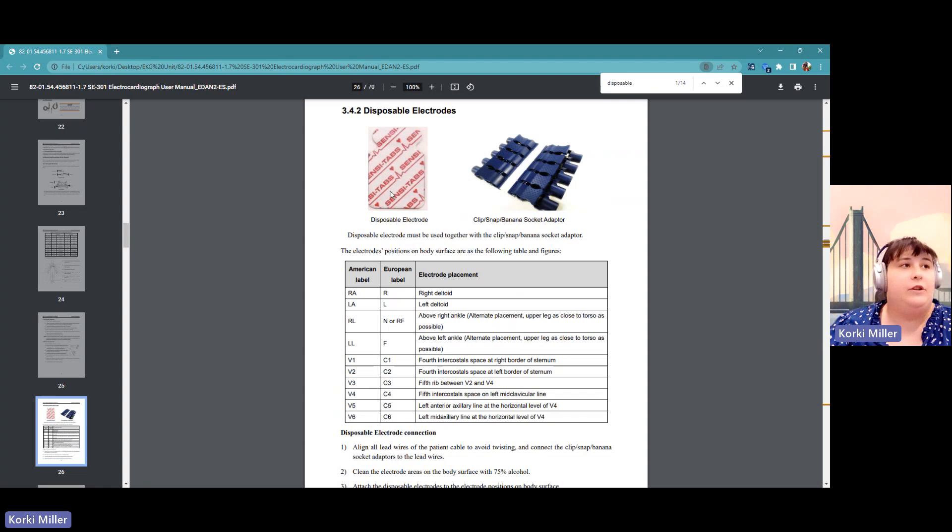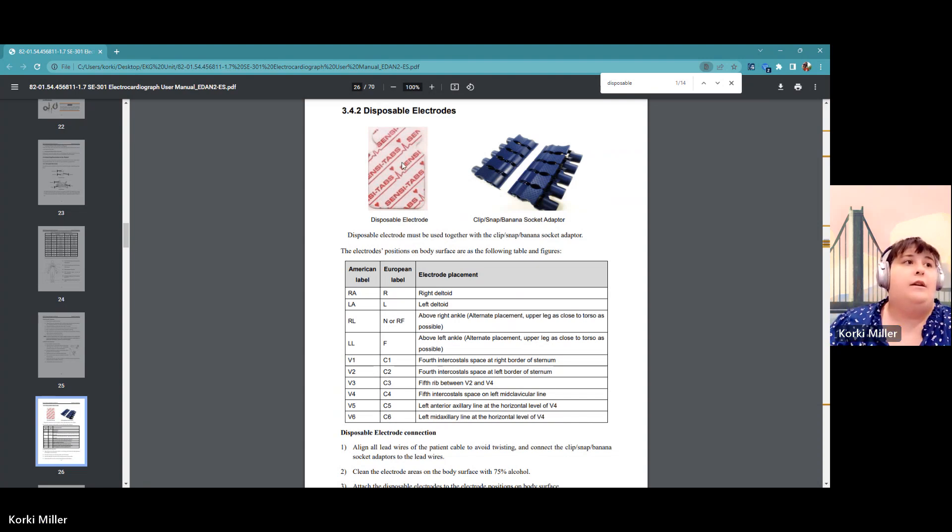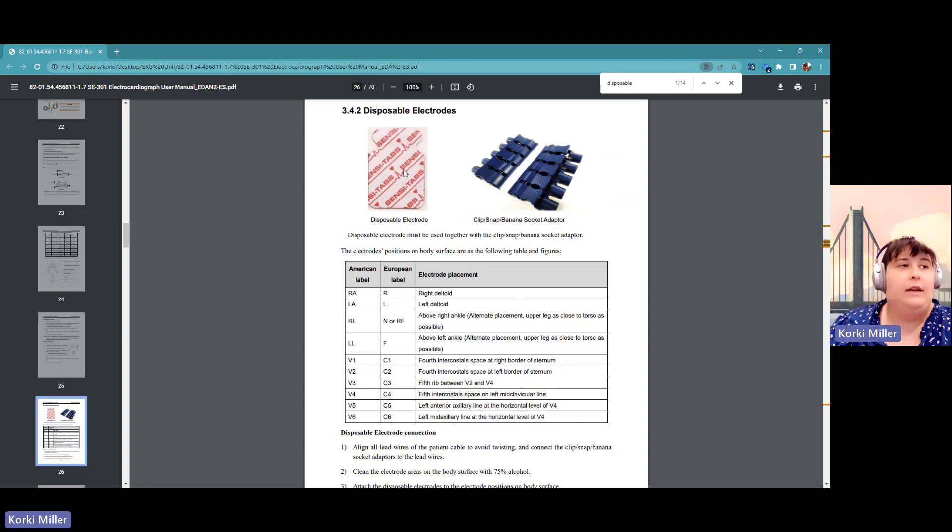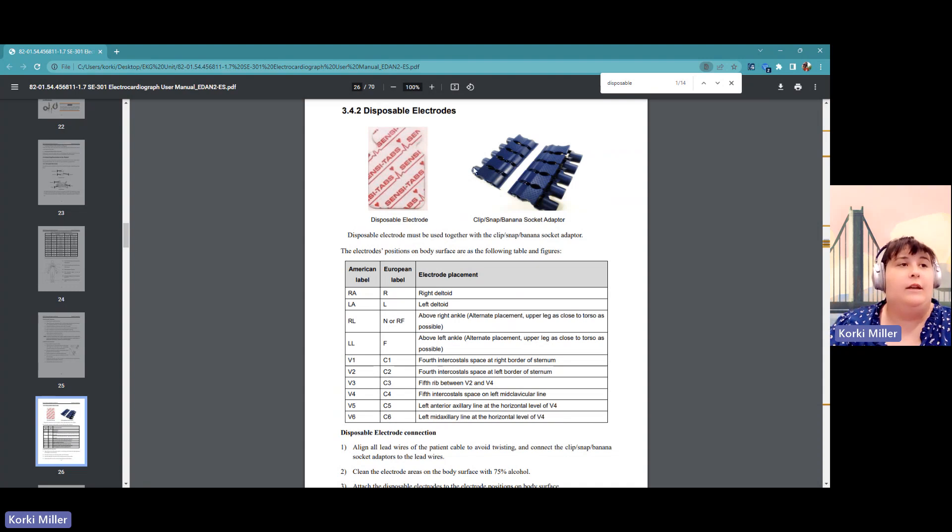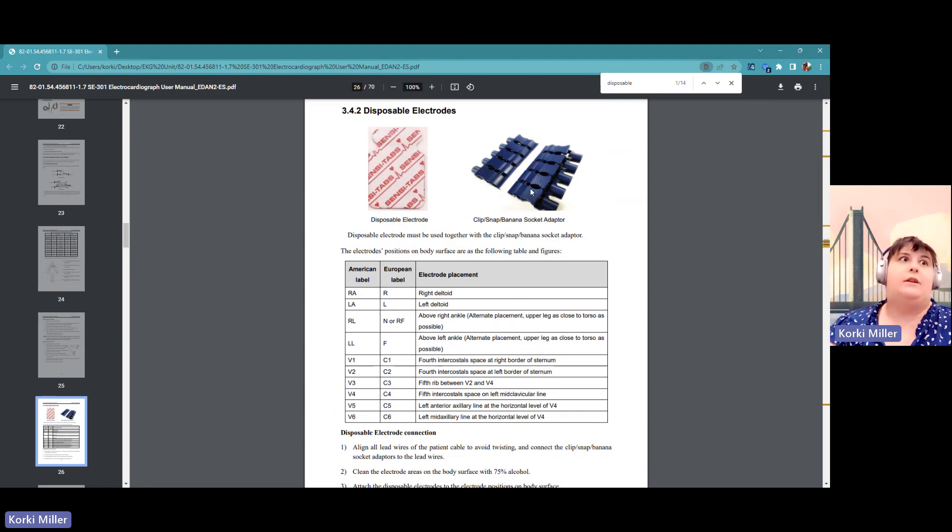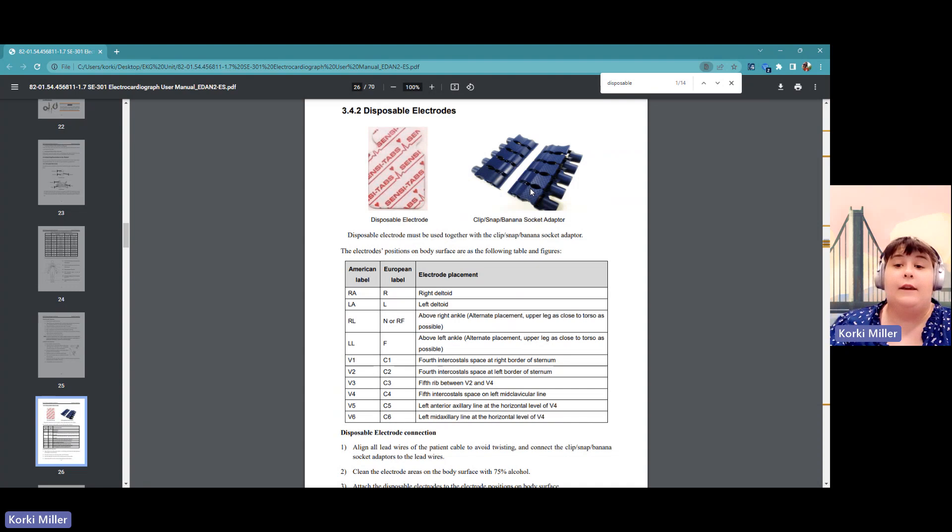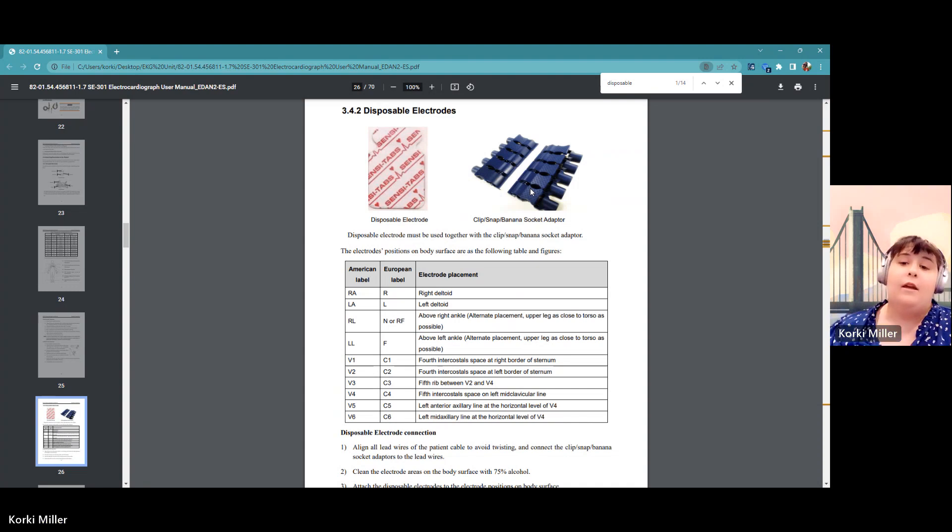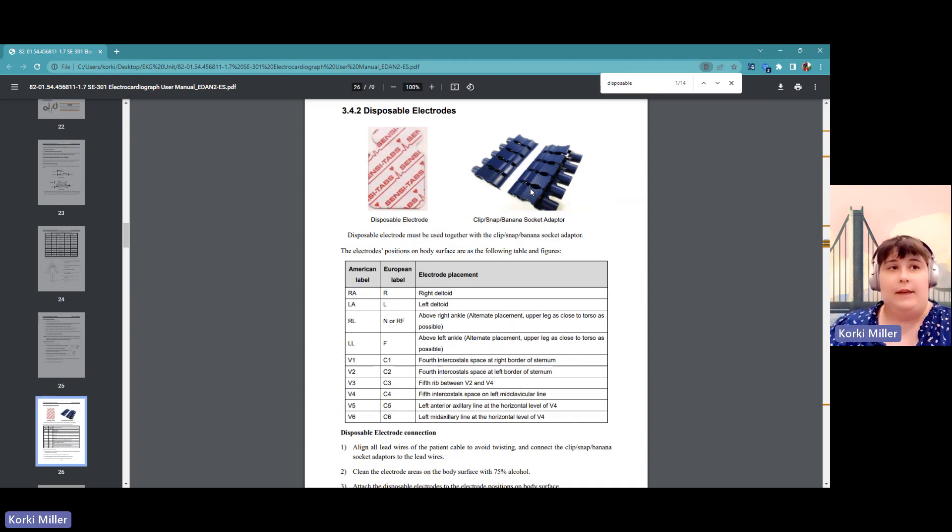It is very important to make sure that you have good clean skin. Attaching to disposable electrode, make sure that electrode gel has a good adherence to the skin, and you want there to be good connectivity between the skin, the electrode gel, and the adapters, the metal part of the adapters, because that's what's going to carry the electrical signal from the patient to the EKG.